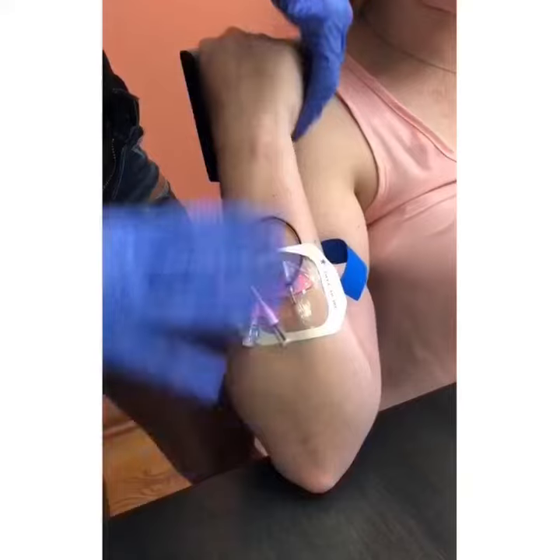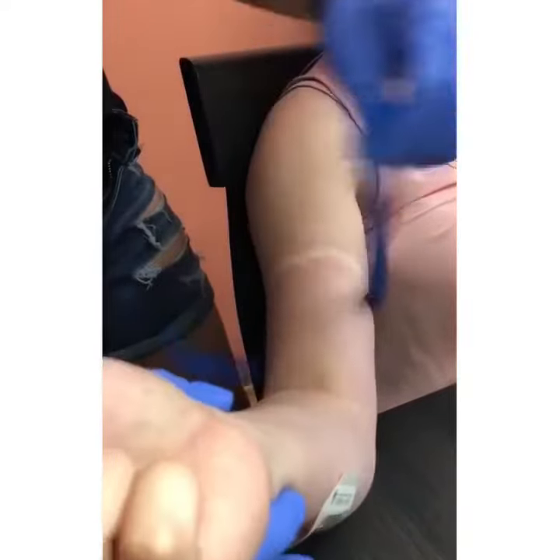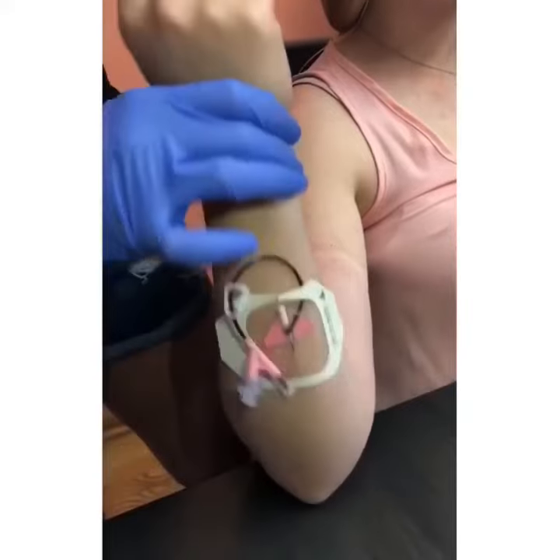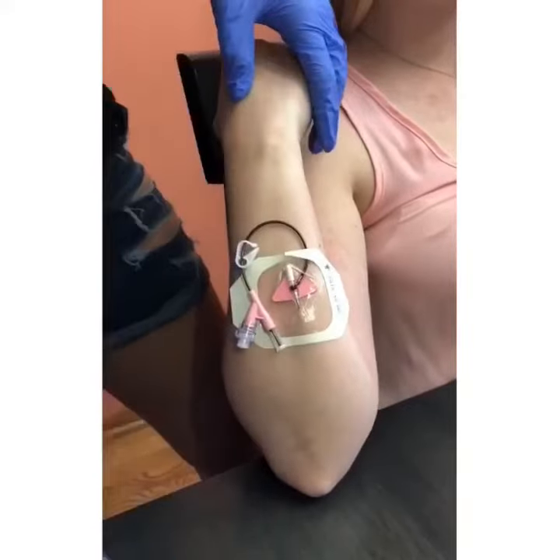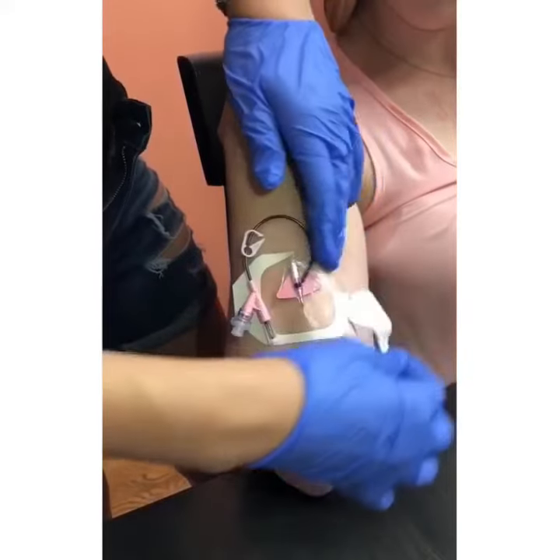I love IVs here mostly because these veins are rarely used and they are much less likely to be scarred up from frequent IV starts. They are also much bigger in diameter and straighter compared to other areas.